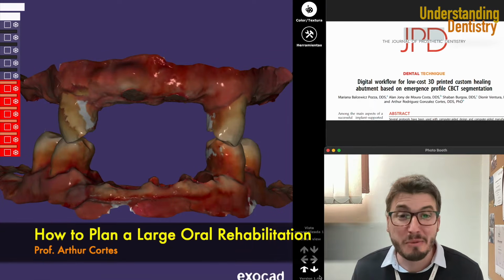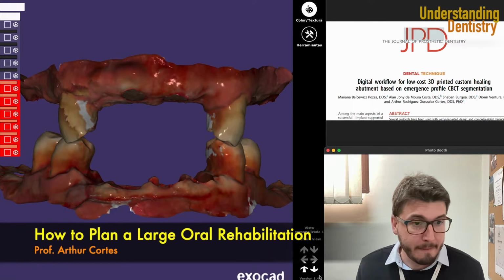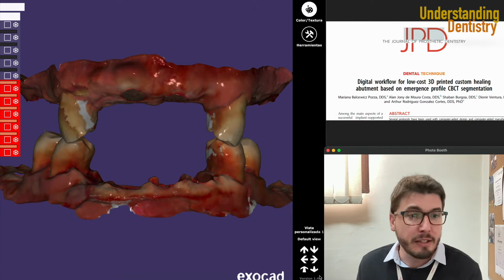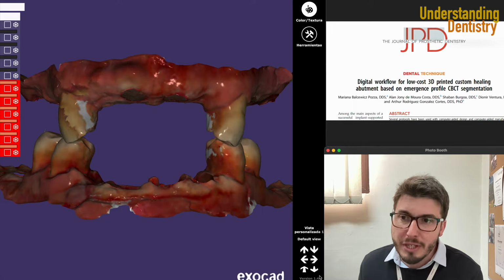Hello guys, and welcome to this video to see what you would do if you see a patient like this. Very common situation in the clinic. You have a patient coming with a failing dentition or partially failing dentition, and then you need to take decisions on what to do here. So let's consider this situation.